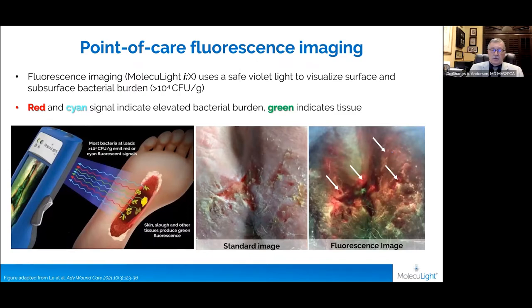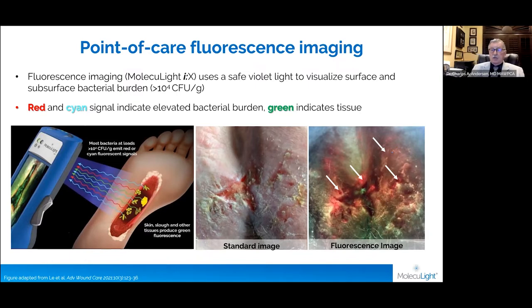This is the device we use. It does not require any kind of injection and is able to detect, as you've heard in other presentations, greater than 10 to the 4th bacteria with a red or cyan signal indicating bacteria. As you can see in the image of the pressure ulcer in the adjacent picture, you can see fluorescence not only in the wound but extending into the adjacent tissue.